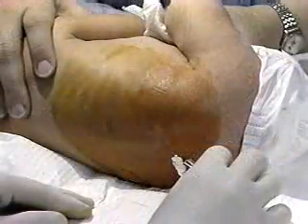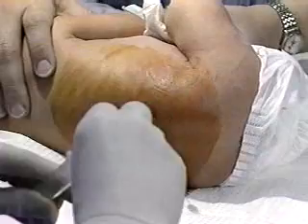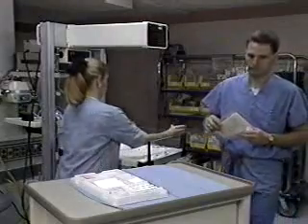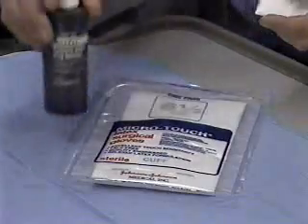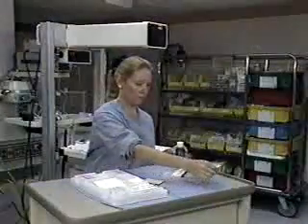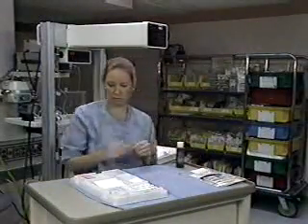The lumbar puncture procedure requires 2 highly skilled people, the practitioner and the assistant. To prepare for the procedure, the practitioner needs to obtain sterile gloves, betadine, patient labels for the CSF specimens, and a prepackaged lumbar puncture kit.